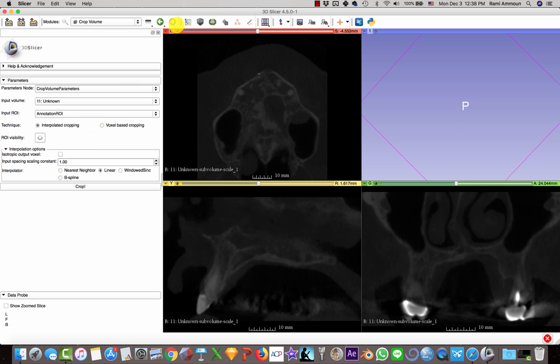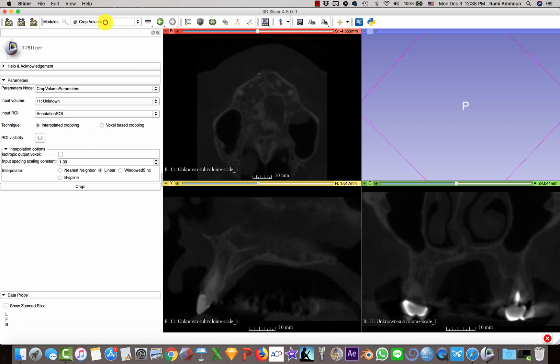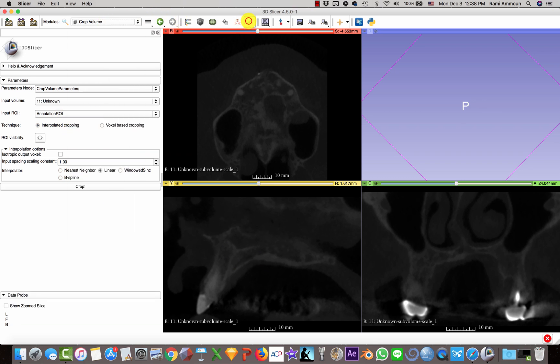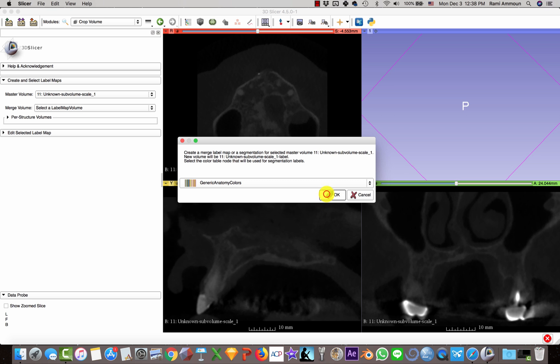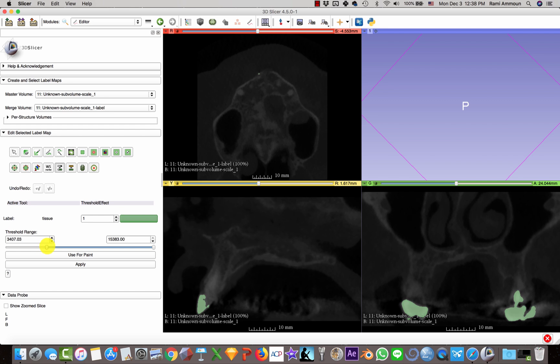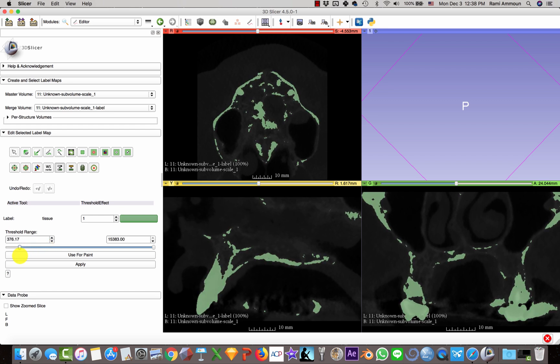After this, I'm going to click the Editor button here, and I'm going to go to the Threshold Effect.